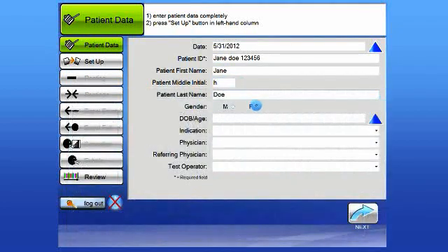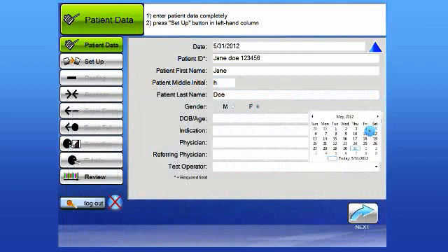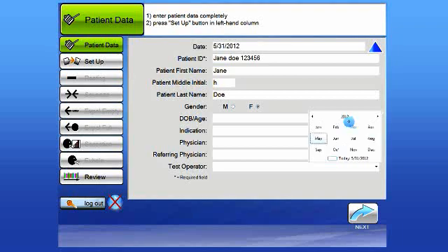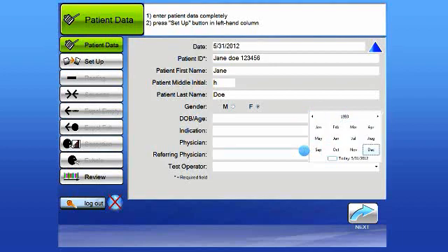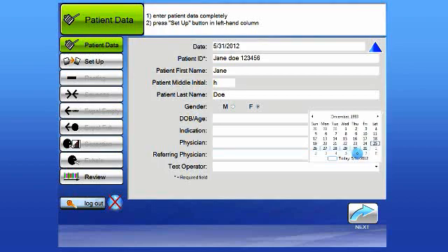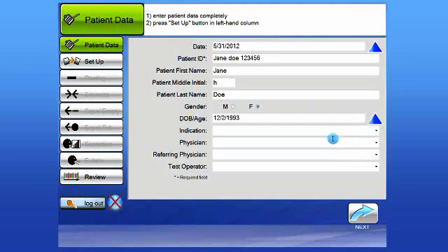Enter the sex of the patient. And now enter the patient's date of birth. The date of birth can be done by a pull-down menu. By selecting the pull-down menu and tapping twice on the year, you can navigate to the proper year. Make the choices for both the month and then the day, and the date of birth will be entered in that field.